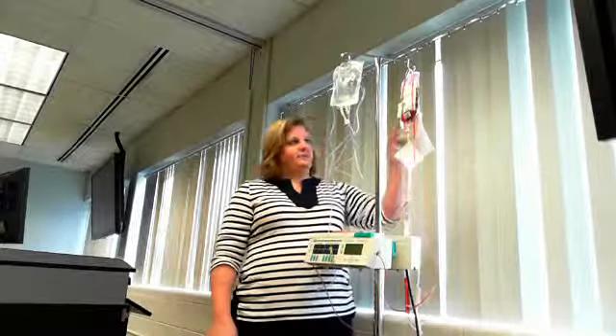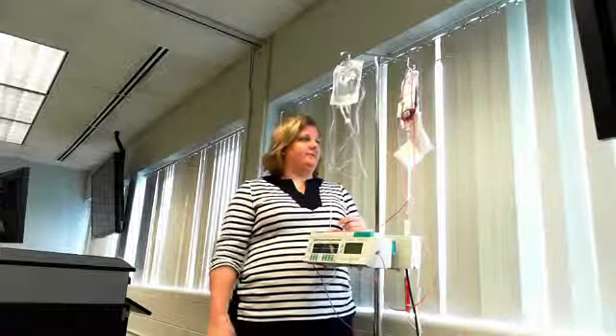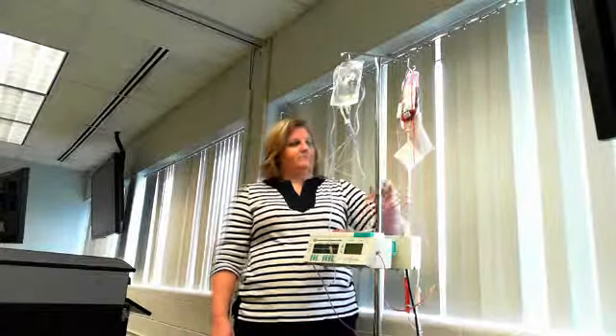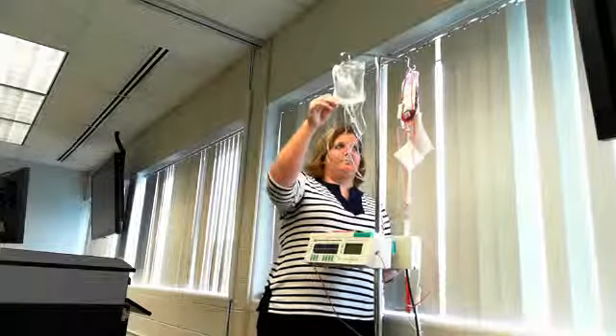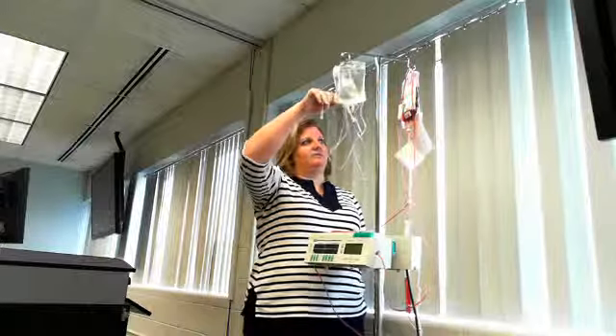From the time you pick up your blood, you have 30 minutes before transfusion must be started — 30 minutes from the time you leave the blood bank. You would get a bag of normal saline, which needs to be in the room along with a primary IV kit, ready in case the patient has any type of transfusion reaction.